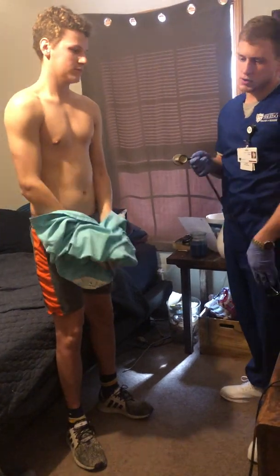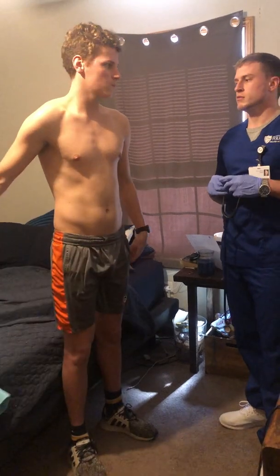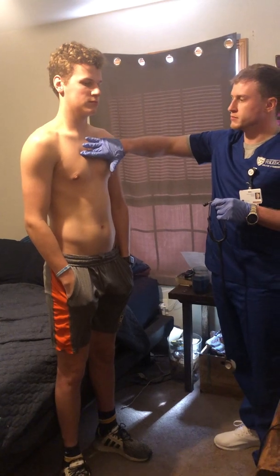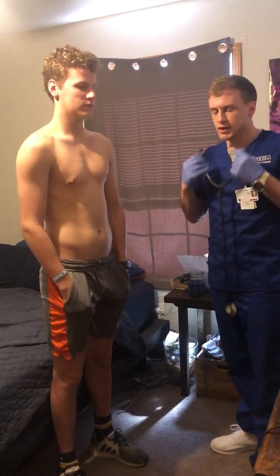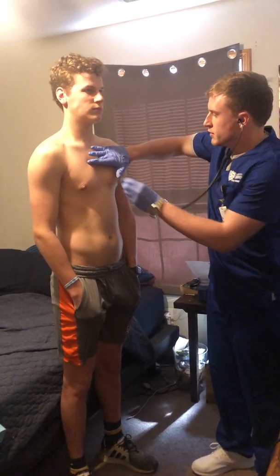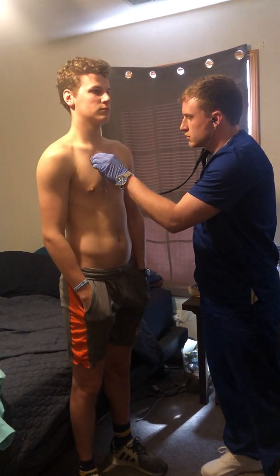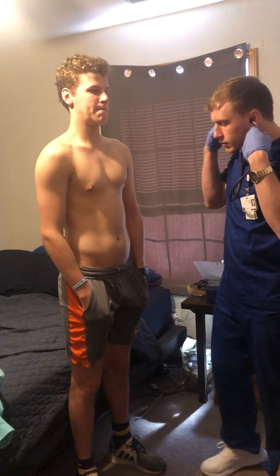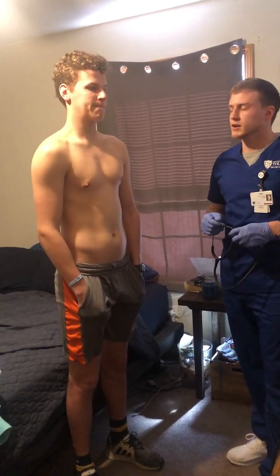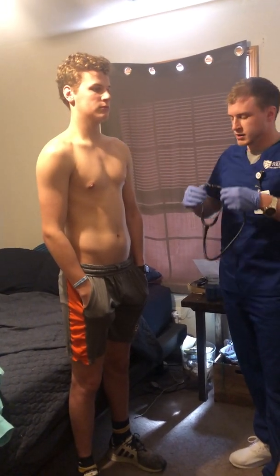Alright, so the first heart sound that we're going to listen for is the aortic heart sound. That one is located on the patient's right side at the second intercostal space below the clavicle, on the right sternal border. So I'm going to go ahead and listen for that one first. Alright, the next heart sound I'm going to listen for is the same, just on the other side. This is the pulmonic heart sound. So I'm going to go from the clavicle down to the second intercostal space and give that a listen.